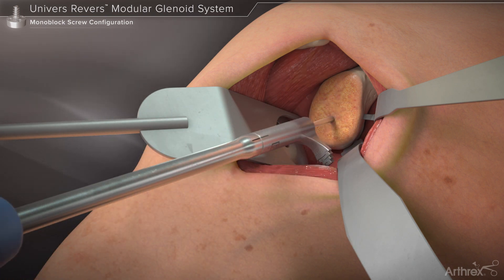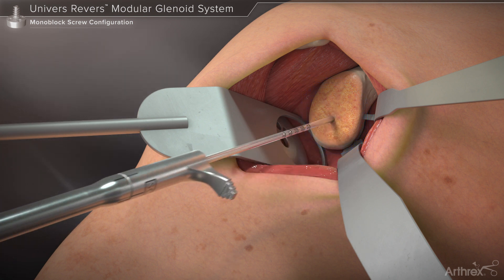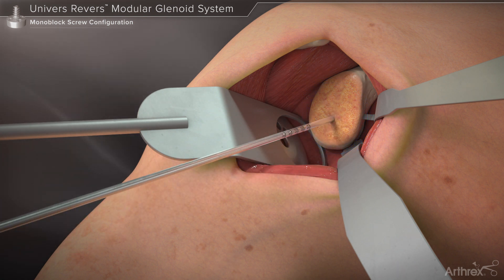The glenosphere sizing guide may then be placed over the guide pin to visualize the location of the inferior most rim of a chosen glenosphere size. Each step in the guide corresponds to a size of glenosphere offered within the modular glenoid system. If determined that the position of the glenosphere is not ideal, the surgeon may remove the pin and reposition it.